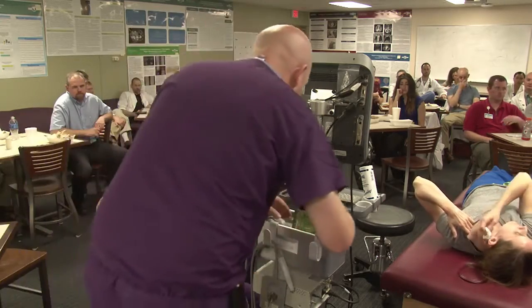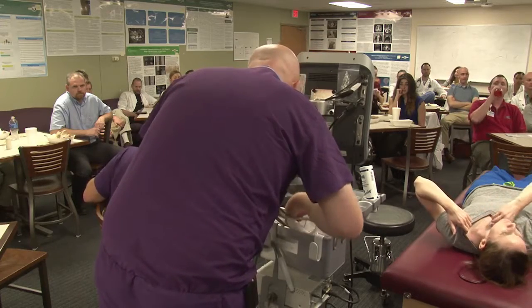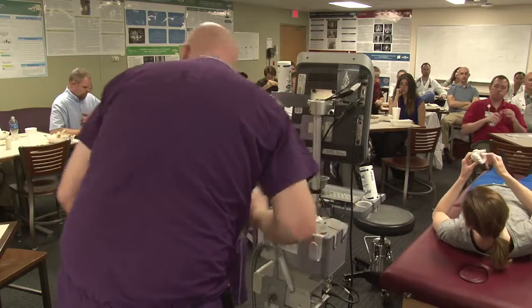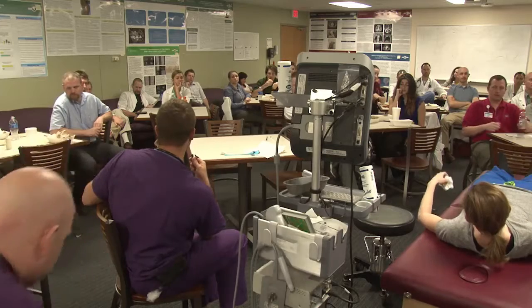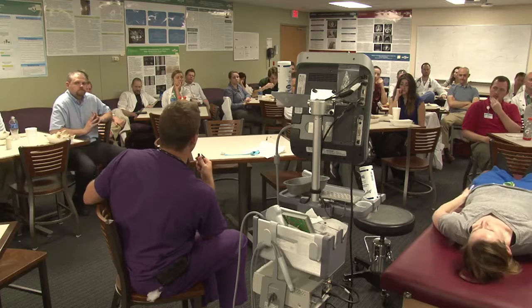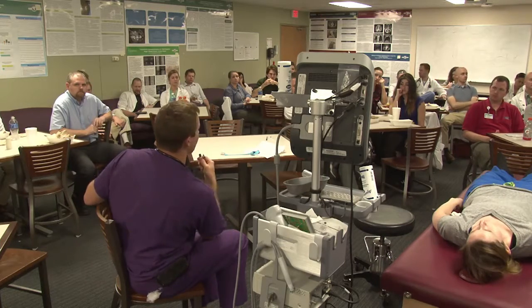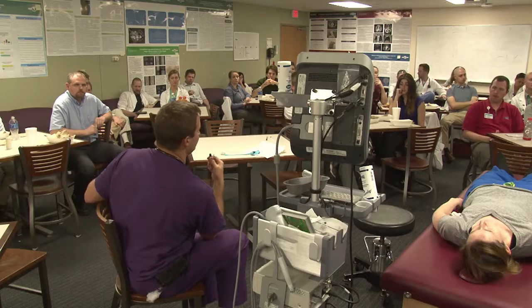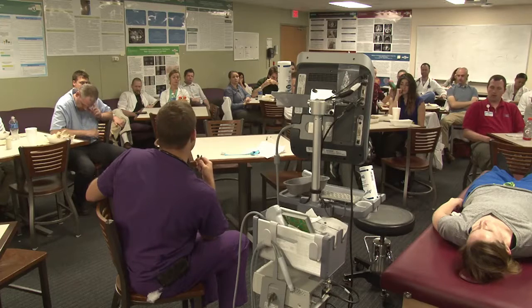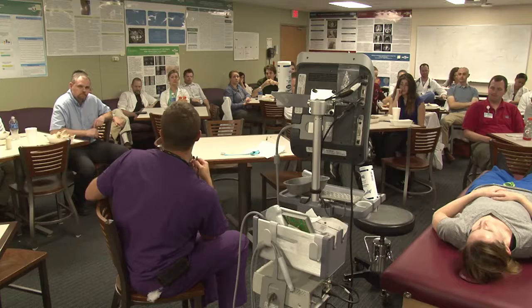Maybe we'll get lucky and have one. Anyway, we're able to run a small amount of electrical current through the nerve stimulating needle. When the needle tip gets close to the nerve, it stimulates the nerve, and we see muscle twitch. So it's one way to know you're aiming for the right target. Here in Kirksville, we actually use ultrasound plus a nerve stimulating needle. It's probably overkill, but it certainly is not going to hurt anything to use that nerve stimulating needle.